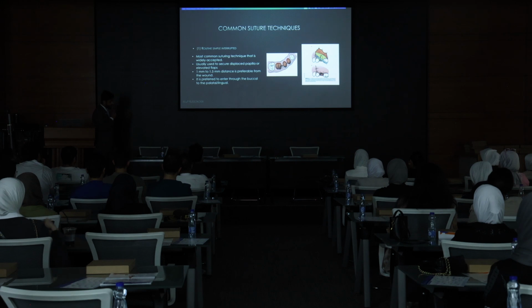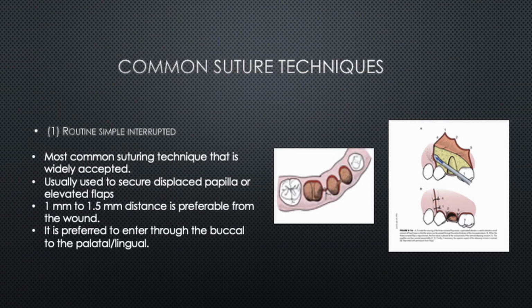All right, so let's talk about the most common techniques. Of course, you all know the simple interrupted. It's the most common one used. The advantage of using this one is, let's say you have a long laceration and you place a couple of stitches: if one of them breaks or falls, then you have the rest holding the laceration.